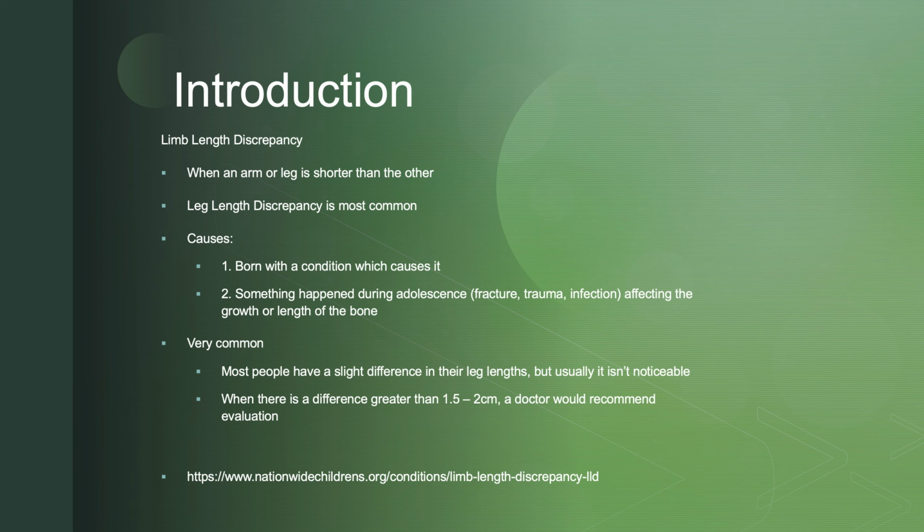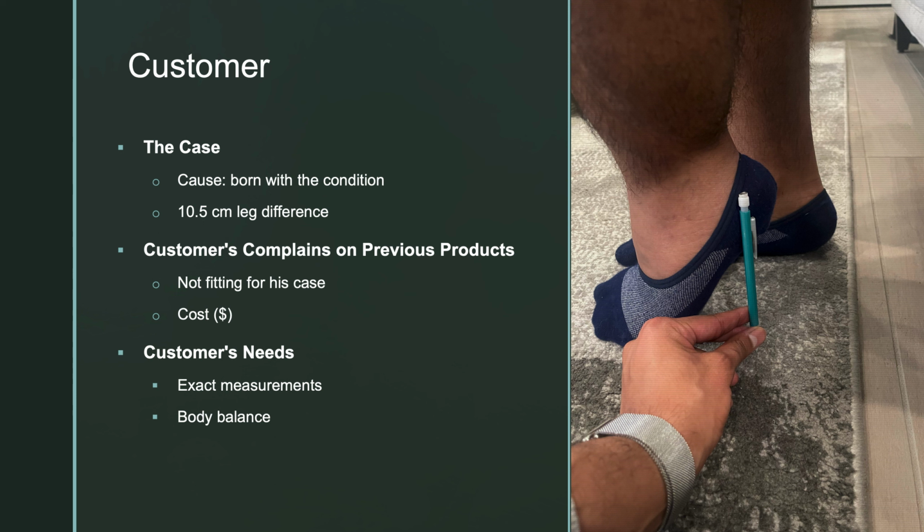But when someone does have a difference that is greater than 1.5 to 2 centimeters, a doctor would recommend being evaluated to see if treatment is needed. In the case we studied here, our customer's difference in length was much greater, which Turki is now going to go into more detail on. So, as Ashley mentioned, our customer's difference is much greater than 1.5 or 2 centimeters.